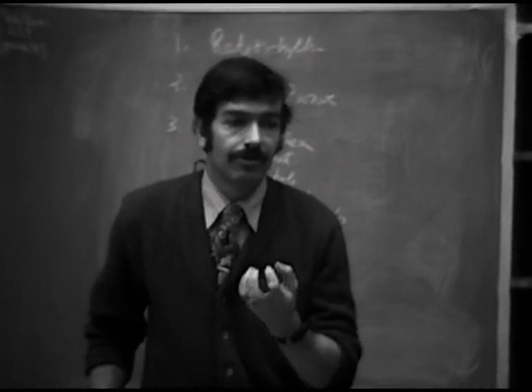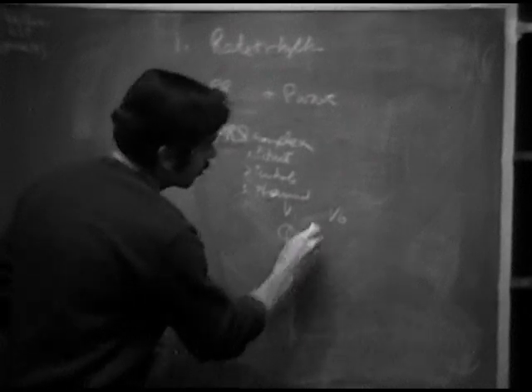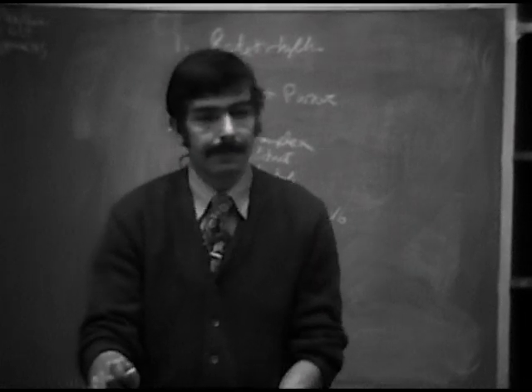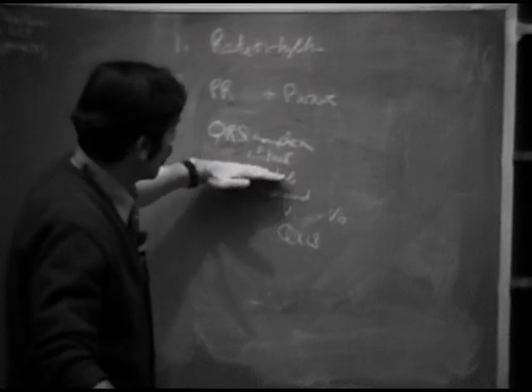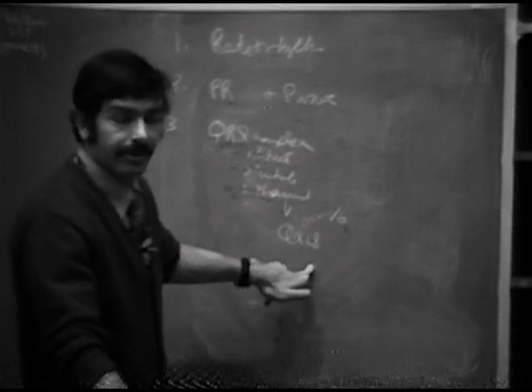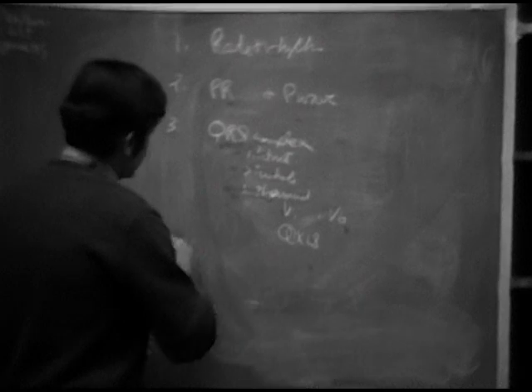Once you've decided that you're dealing with a right or a left bundle branch block, you go back to the frontal plane and you look at the axis. And that'll tell you whether you're dealing with one of the hemiblocks or a combined block. So if you just go through this routine: QRS wide, initial, the whole thing, the terminal thing. If it's terminal, look at V1 and V6. Decide whether you're dealing with a right bundle or a left bundle. Then look at your axis to see whether you're dealing with an anterior, posterior hemiblock or complicated block.